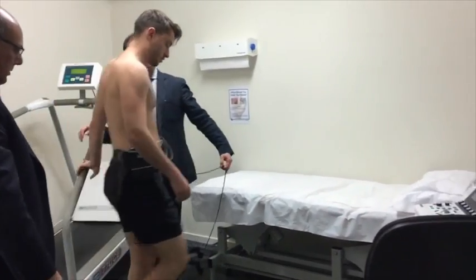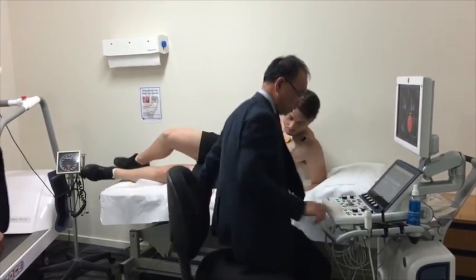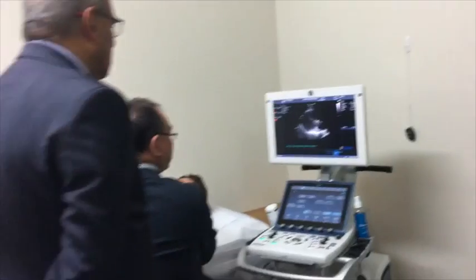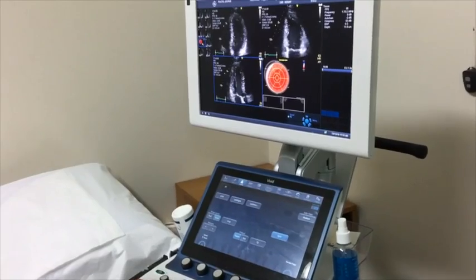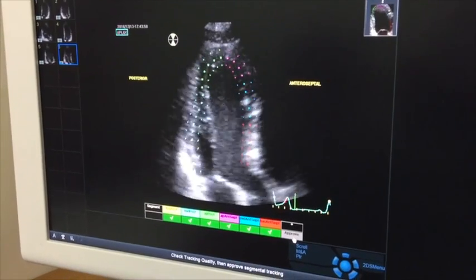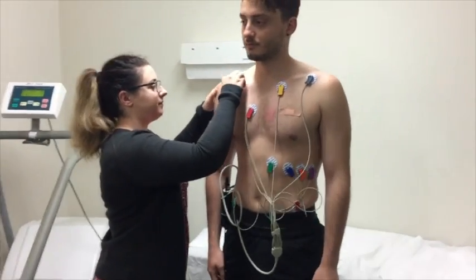The treadmill is stopped when you reach your maximum level of exercise or when the doctor determines it is time to stop. When the treadmill comes to a complete standstill, you will be asked to come off the treadmill and lie down on the bed in the same position. The echo technician will be ready to scan your heart again to take stress images with the same ultrasound probe.